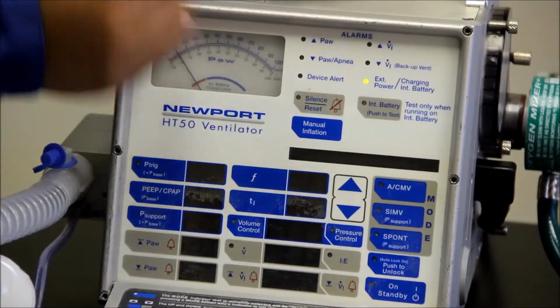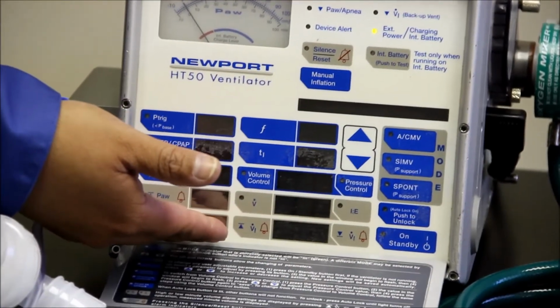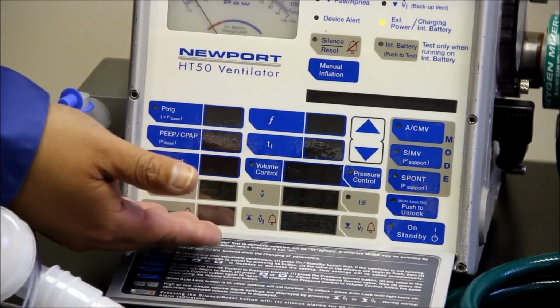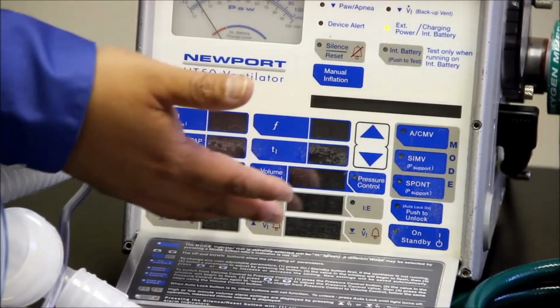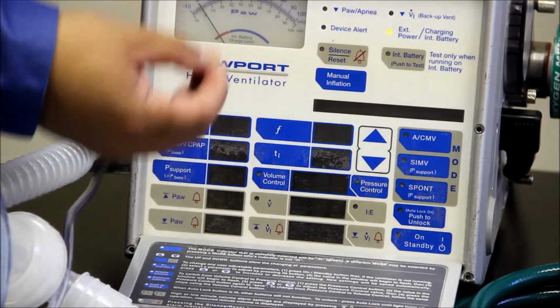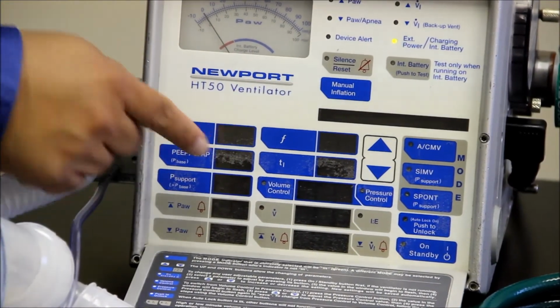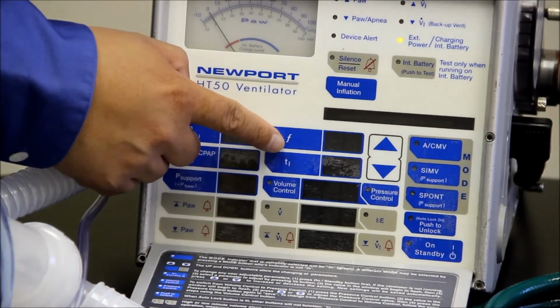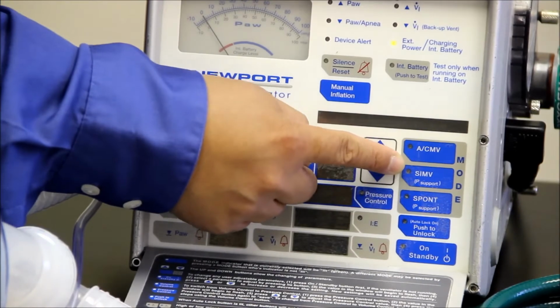Okay, so just before I turn it on, I'm just going to go through a little bit of the important buttons here. So that as nurses, these are the buttons that we're going to be most concerned with. There are all sorts of things that I can do, but I'll just keep it basic so that we actually understand the basics of mechanical ventilation. So first off, this is the mode.